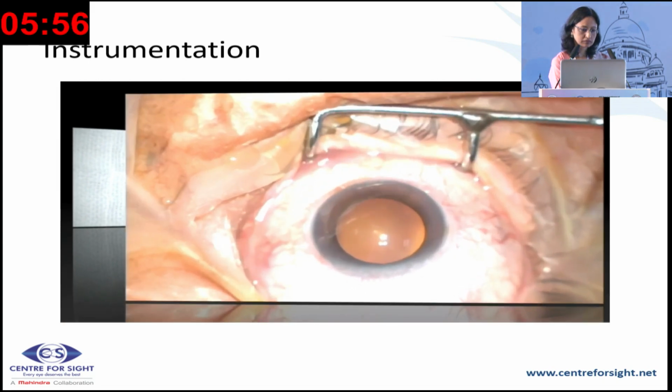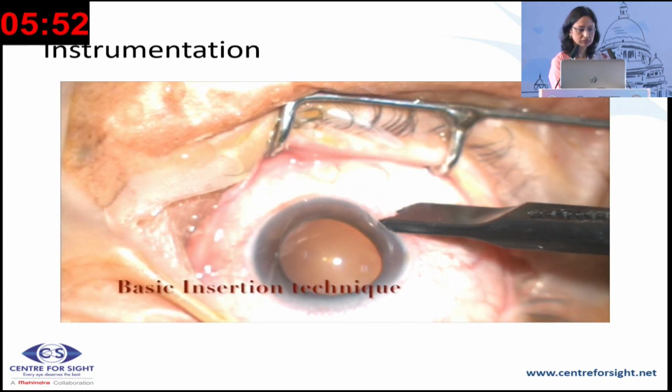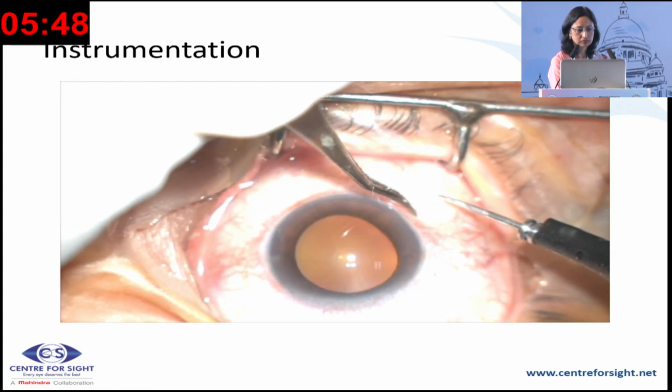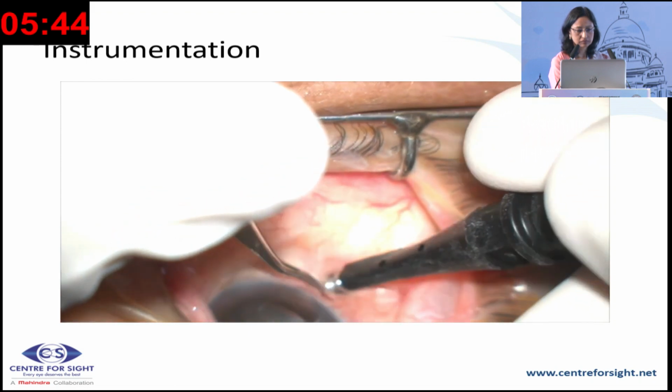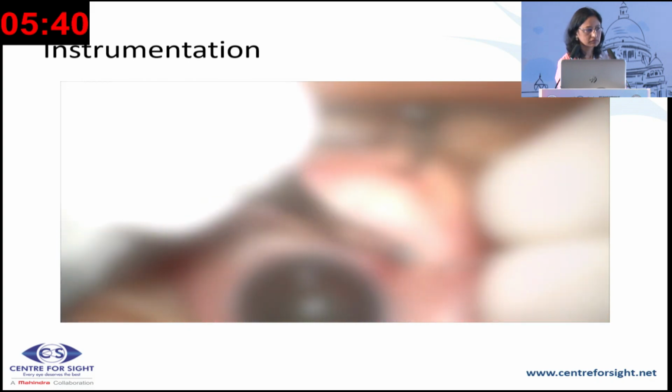In a phakic eye, the cannulas are inserted 4 mm from the limbus. The conjunctiva is retracted slightly, and the trocar cannula is inserted in a 2-step fashion, initially going parallel to the limbus for half its length and then going perpendicular to enter the sclera.